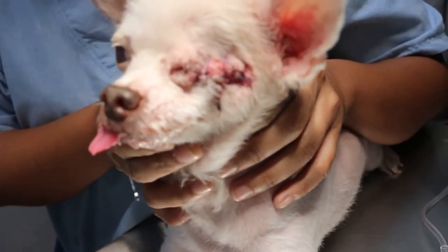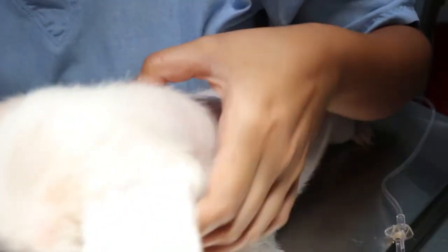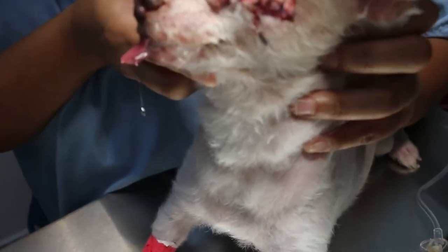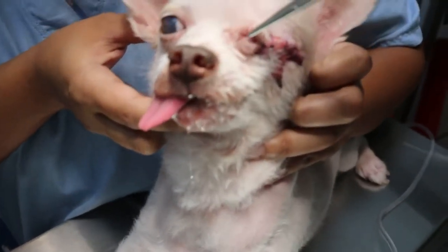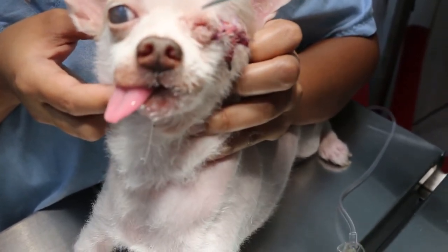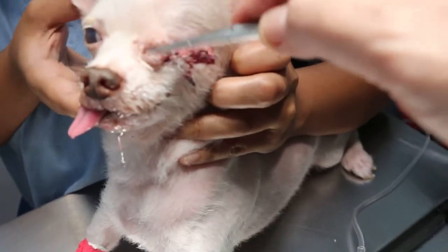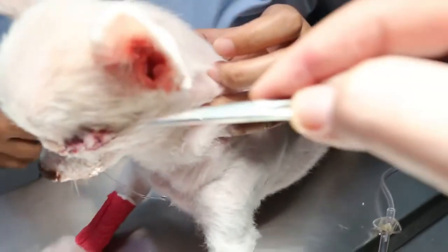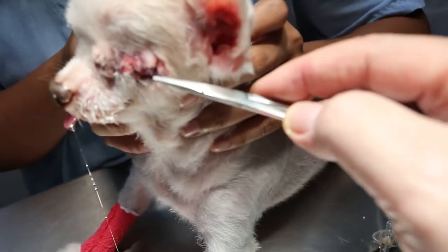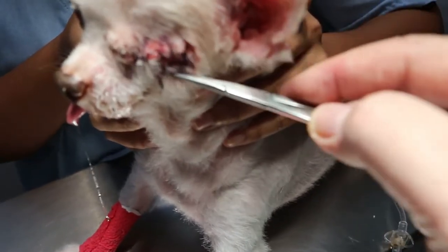Now the medial canthus, of course, you don't cut off. Then I can show you the medial canthus. This part is the medial canthus. This part is not cut off, so that any fluid can flow out. Otherwise, it closes everything and nothing will flow out. But as you can see, there's no bleeding. Otherwise, the blood will flow from here. And okay, the lateral canthus has also been stitched up. This is the lateral canthus, about 1 centimeter, and this is the lid margin.